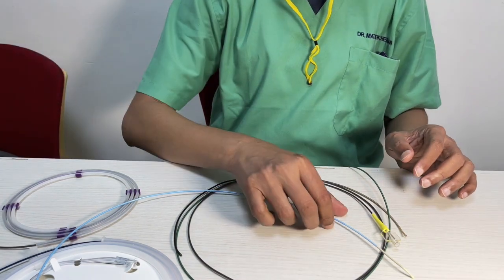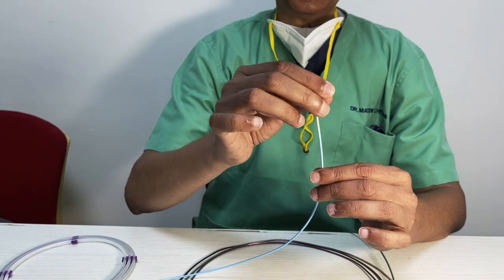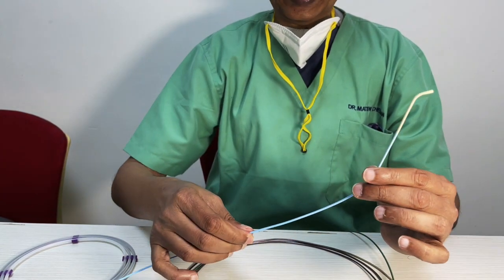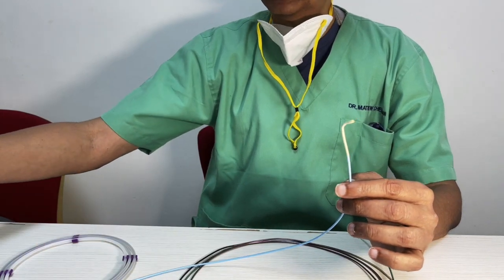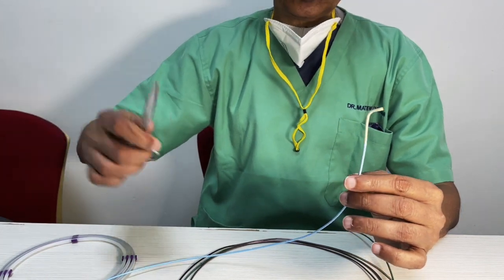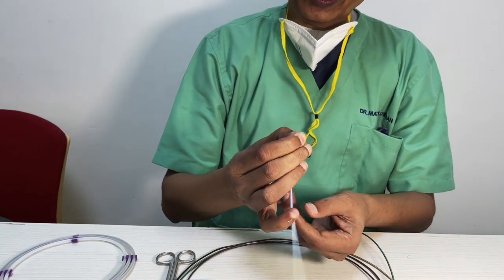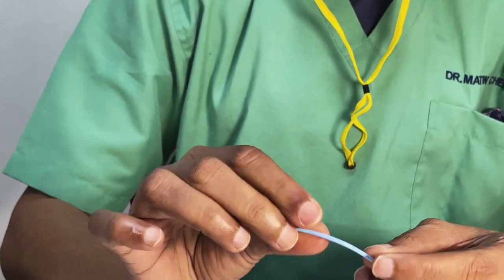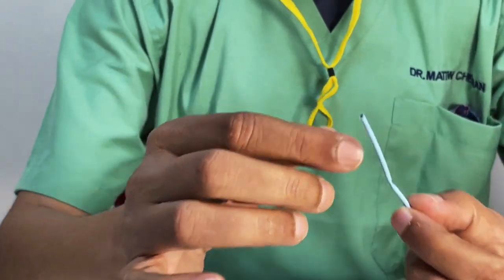Now, like I said, the guiding catheter's problem was it is a reasonably stiff device with a little bit of a soft tip on the end, which is supposed to actually help us. Now, this has got a braiding that is there along the main shaft. So if I cut it, I'll show you the things that happen over here. So let's take a scissor. If you try to cut this point, you'll find there is actually steel braiding. It is probably difficult for you to see it, but this is braided, and you can understand the fact it will never break, but it gets badly kinked.